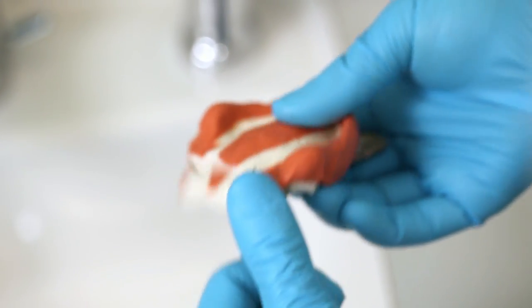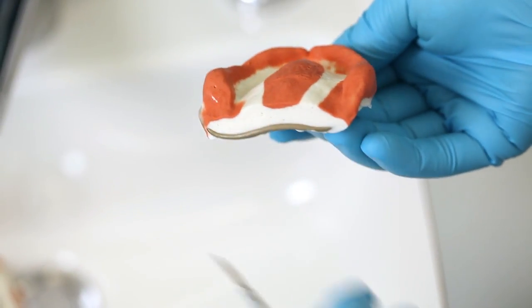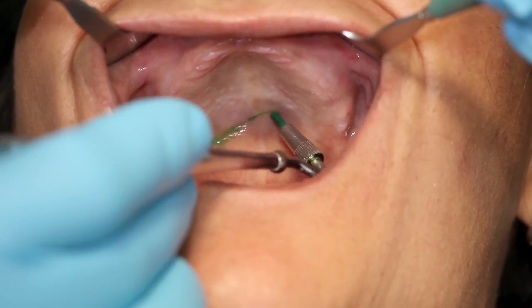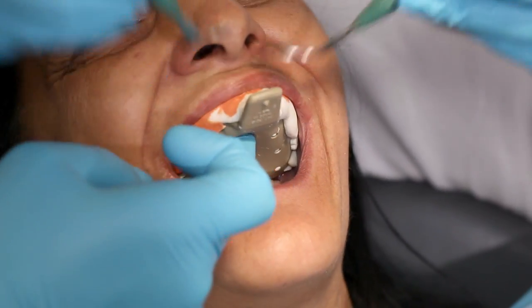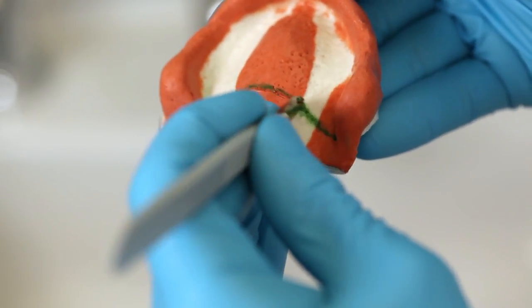Remove any excess material in the posterior region. Use a special pen to mark the distal limitation or A-line. This should enable you to transfer the line to the inserted impression. You can additionally carve in the line with a scalpel.